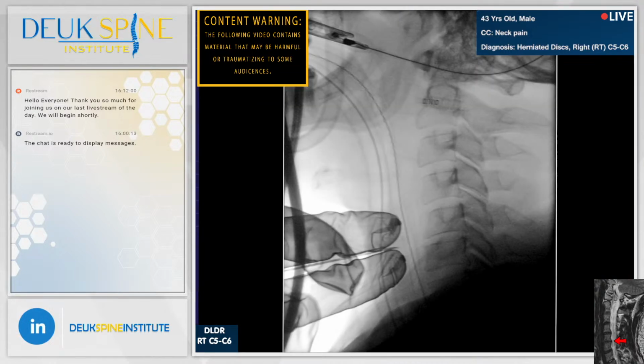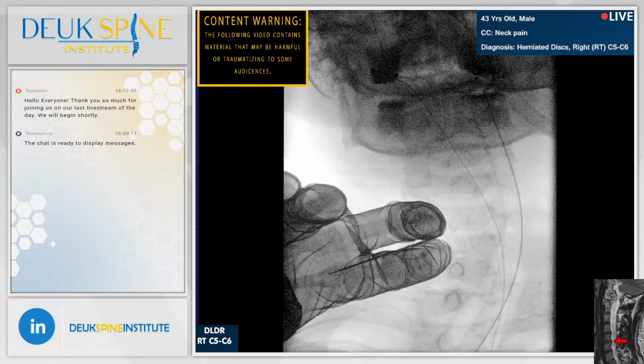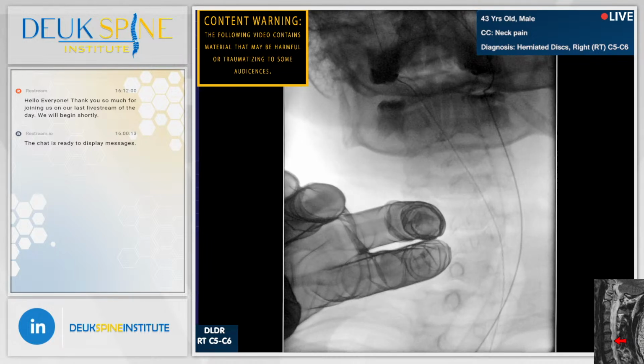Let's get a quick AP and make sure we're in the middle. This is how you do the surgery, folks. It's called anterior cervical endoscopic spine surgery. Perfect. I'm going to go to the middle a little bit. And let's get a shot on a lateral view.